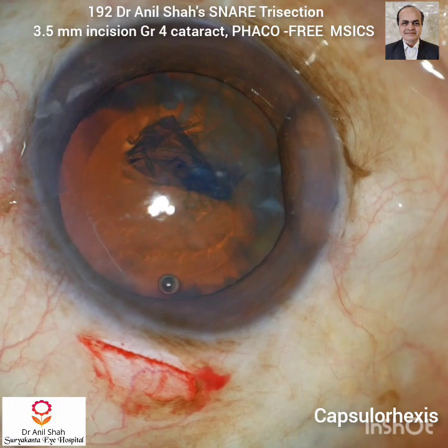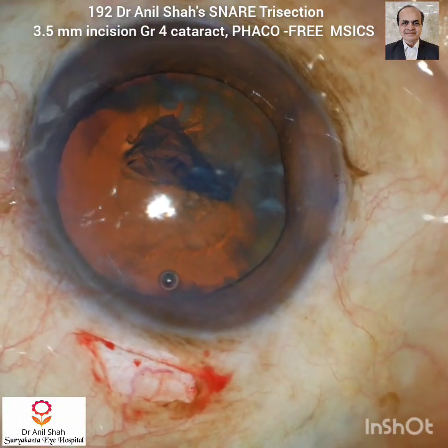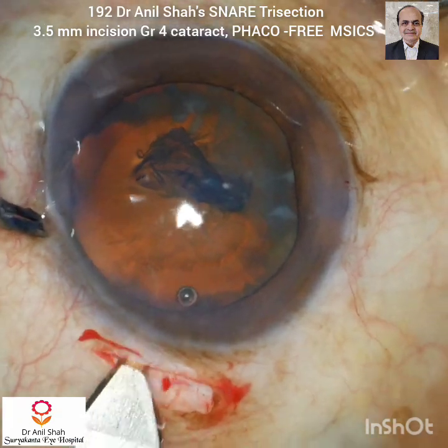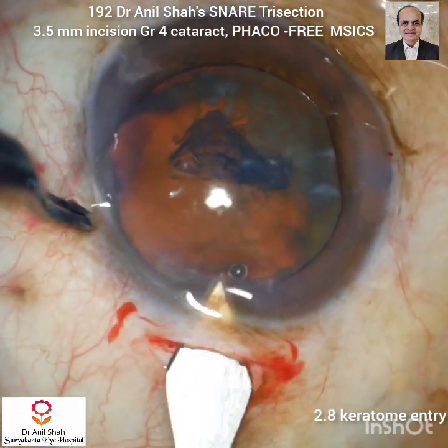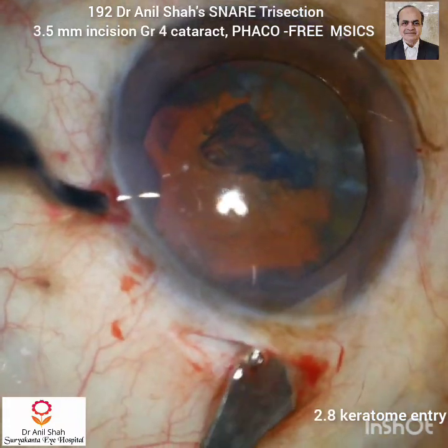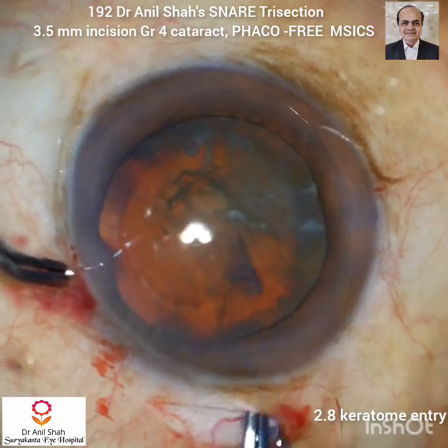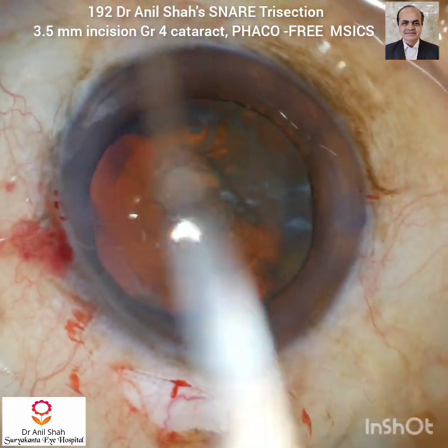Another side port is made. HPMC or sodium hyaluronate is used to demarcate the tunnel. Now with the 2.8 keratome the internal incision is made. It is usually wider than the external incision. I preferably remove the capsular tag.